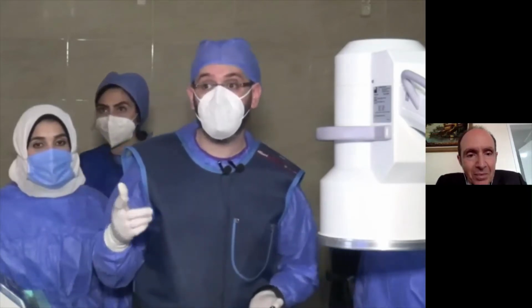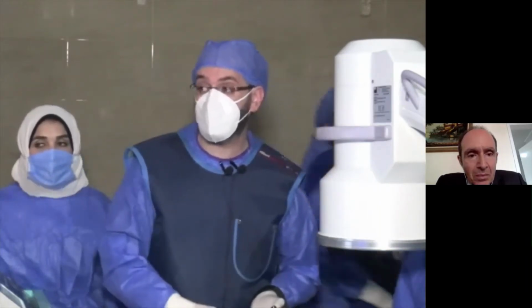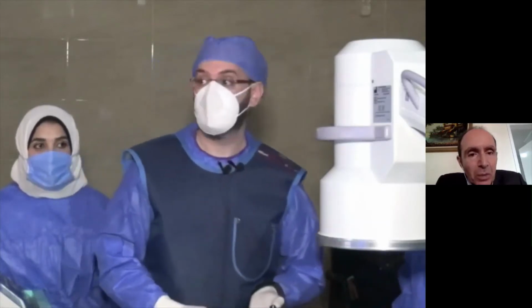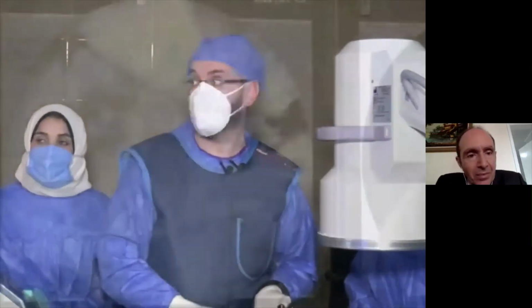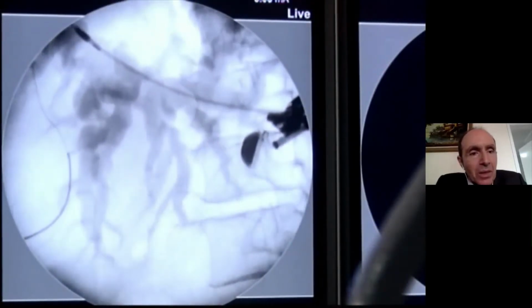Before we go live, we started injection from the left lobe of the liver. As we see in the fluoroscopic image, do you see the fluoroscopic image? Not yet. So please fluoro. You see the fluoro? No, not yet. Okay, it will be here in a second. Okay, we have it. We have this fluoroscopic image.